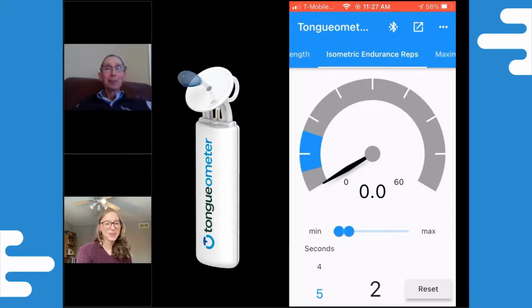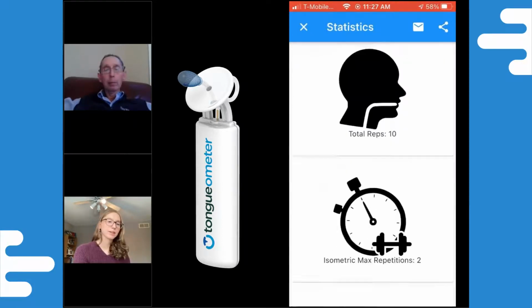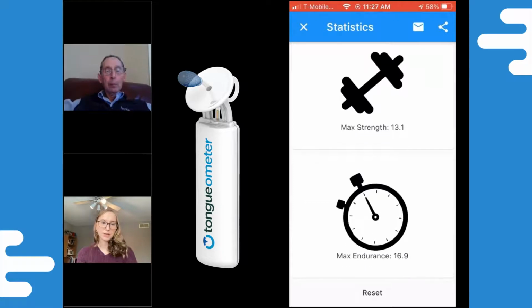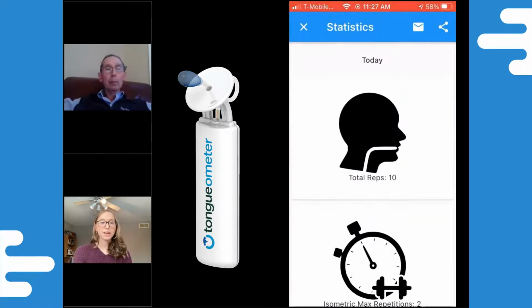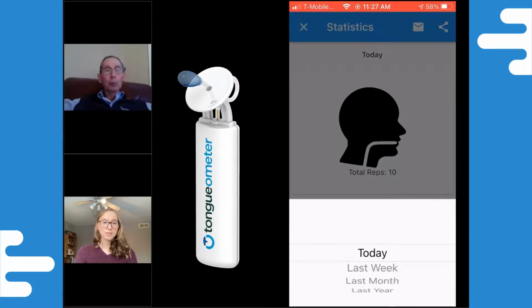Absolutely. And then Ed, if you want to see how you're doing with your exercises, if you click on that data button up at the top, the square with the arrow, it will show you how you've done your exercises for that day. You can also take a look to see how you've been doing for the week, the month, the year. If you click on the button that says today, it will give you those options for how you want to see your data.